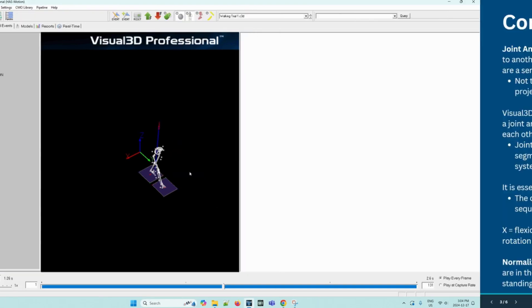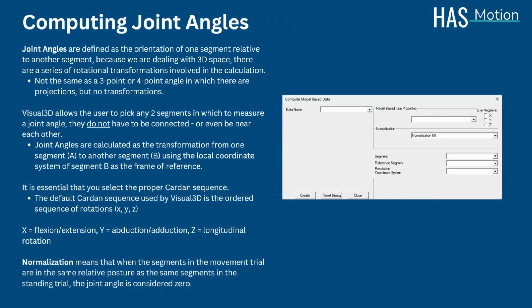Our first step in this tutorial is to compute joint angles. Joint angles are defined as the orientation of one segment relative to another. Because we are dealing with 3D space, there are a series of rotational transformations involved in the calculation. A joint angle is not the same as a 3-point or 4-point angle in which there are projections but no transformations.